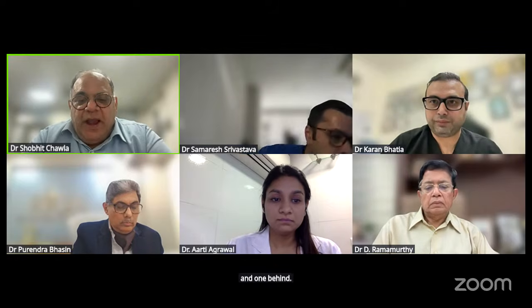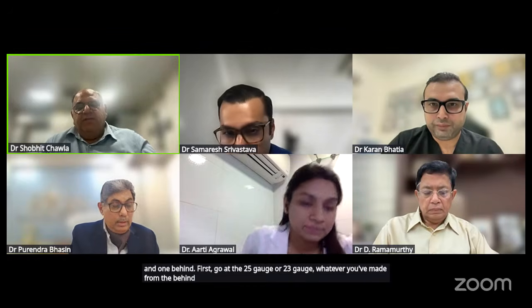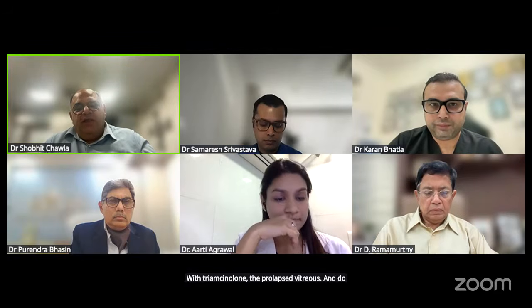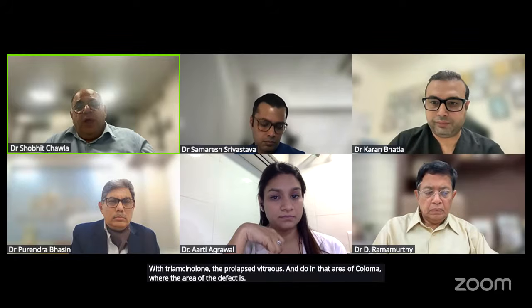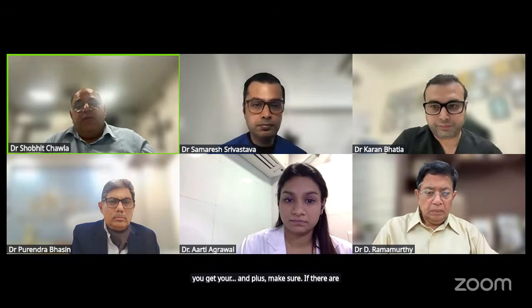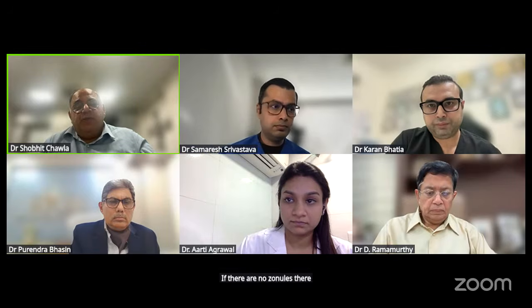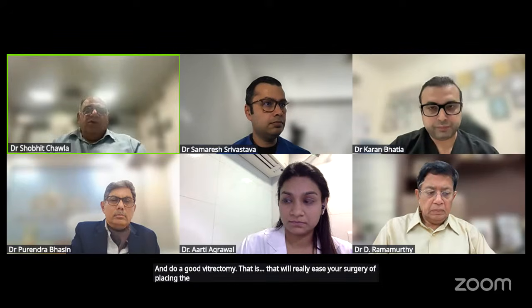First go with the 25 gauge or 23 gauge from behind, after staining the prolapsed vitreous with triamcinolone, in the area of coloboma, where the defect is. If there are zonules there, go from the anterior part. If there are no zonules there, then go from the posterior part and do a good vitrectomy. That will really ease your surgery of placing the ring and make it very comfortable.